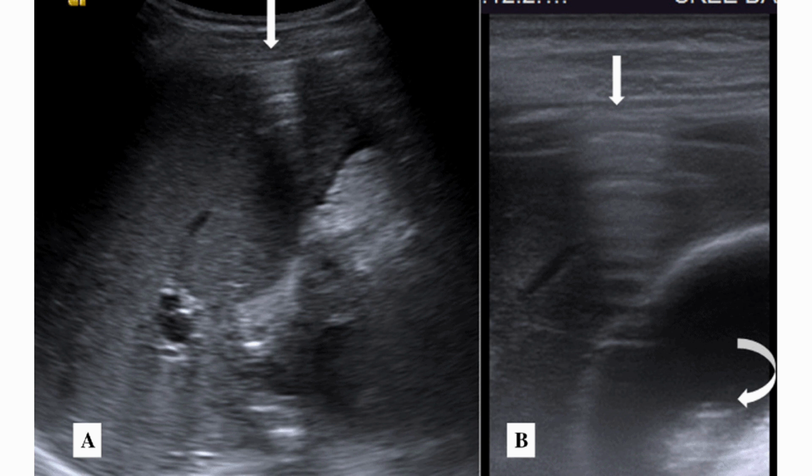Here we're seeing what's actually air artifact. I discussed earlier what different densities do with ultrasound signal. Air just disperses it, so the ultrasound signal just flies everywhere once it hits air, and you get a lot of artifact. So if you're doing an abdominal exam and you see this kind of artifact obscuring everything, you could be concerned for intraperitoneal free air. It could be air from the bowel, sometimes hard to see. You also need to make sure you have a lot of gel on your ultrasound probe and that you don't have air between the probe and the skin. But again, in the right setting, this would be concerning for free air in the belly.